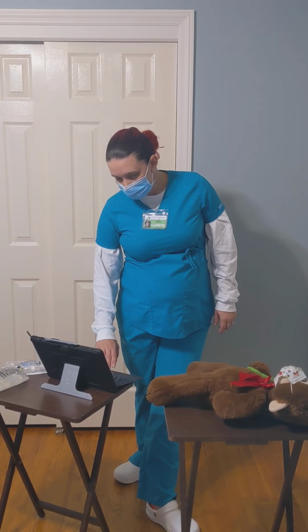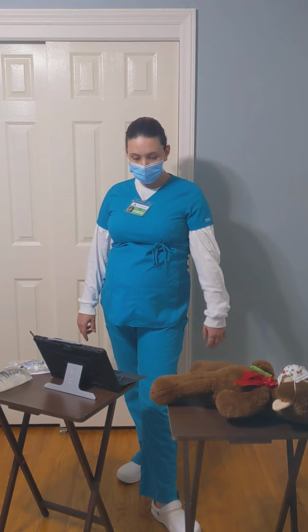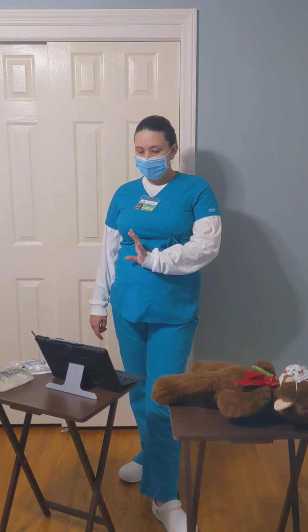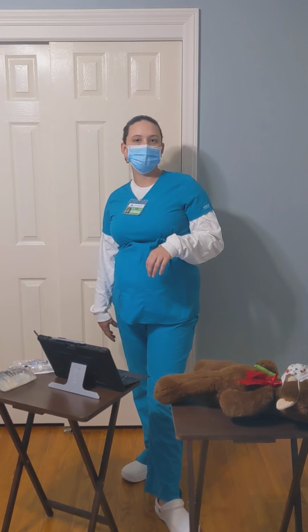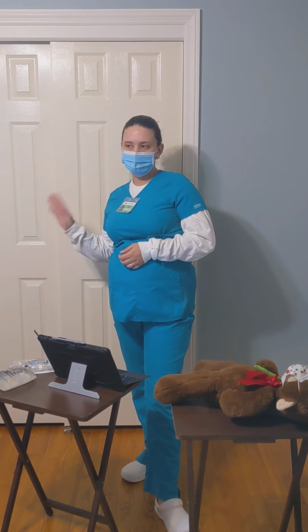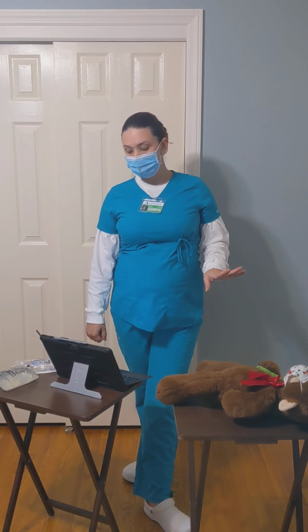Since she is in the ED, we're going to assume we're running this through a peripheral IV line as opposed to a central line that would have a hep block, so she has no continuous infusions. If we were working with a heparin lock, I would pull back and waste the heparin lock and not flush it into the patient, but we'll be using a peripheral line.